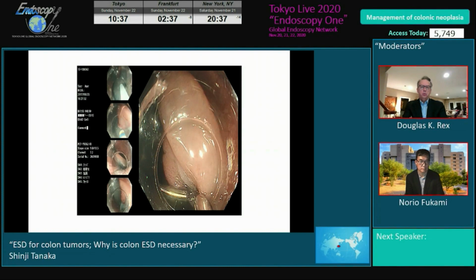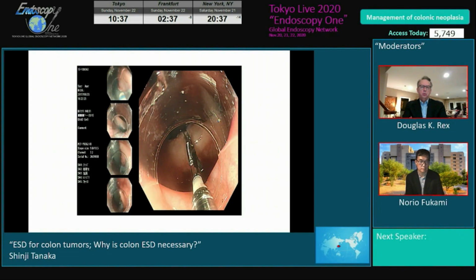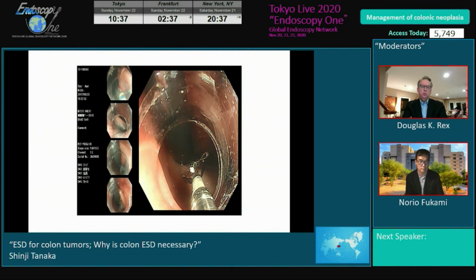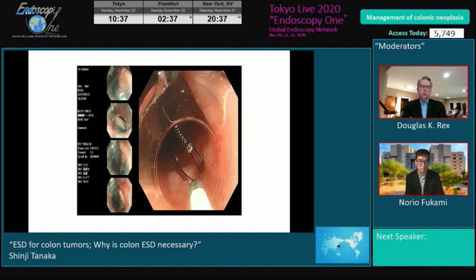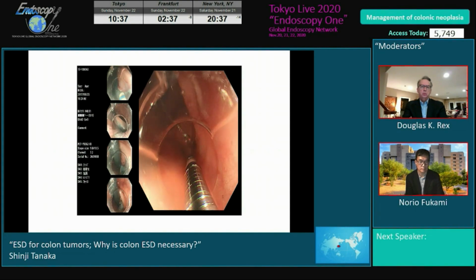At first, we grasp the edge of the lesion like this. Then, by another clip, we catch the small ring of the spring like this. Then, we fix it at the opposite side of the lesion, around 2 folds behind the scope tip.